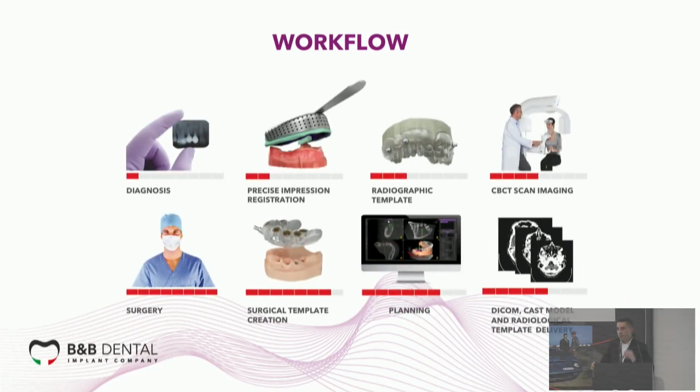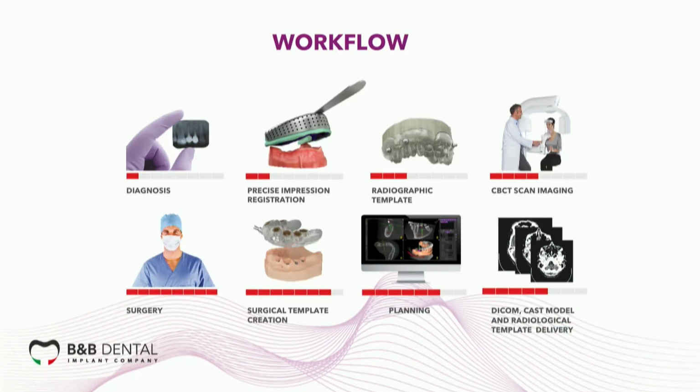This is the usual workflow that we have in B&B Dental. It's composed of 8 steps, from the diagnosis to the surgery: the precise impression, the construction, the release of the radiological template, the CBCT scan imaging, DICOM, cast model and radiological template delivery if you want your project done in B&B Dental, planning and surgical guide creation and model, and the surgery. Very easy, and B&B Dental has created this workflow to bring you to the surgery in an easy way and make all the steps in very little time.